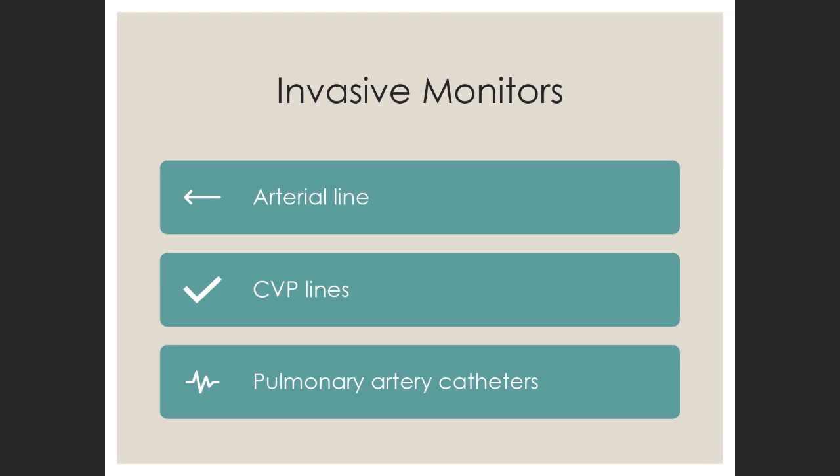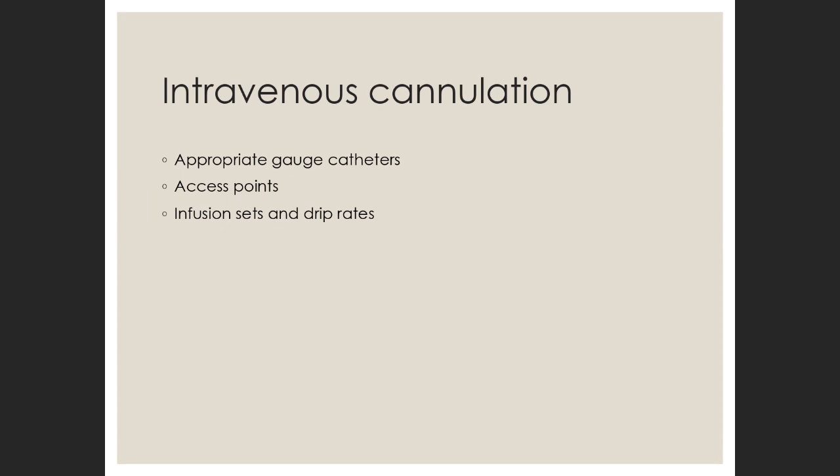Because they have a higher incidence of malignant hyperthermia, even though it is still rare, they are very particular about it. And you may have to have invasive monitoring, like an arterial line for direct arterial blood pressure monitoring, or CVP lines. Pulmonary arterial catheters are used very rarely now.